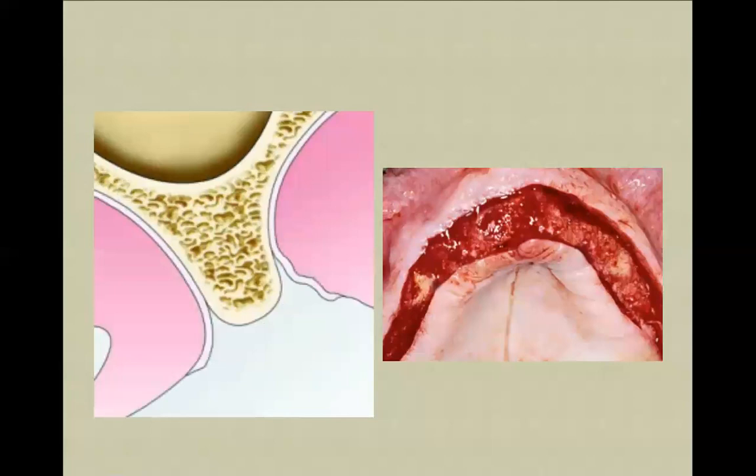healing cup. Once you did your incision, you're using a periosteal elevator, and by means of the elevator, you're just making bone exposure, making the elevation of the flap. It might be extended or it might be limited. It depends on the quality of the bone.